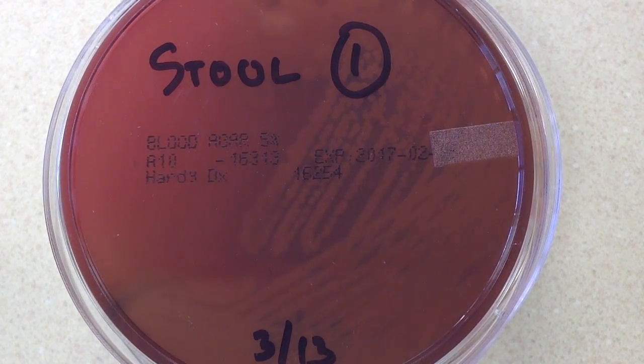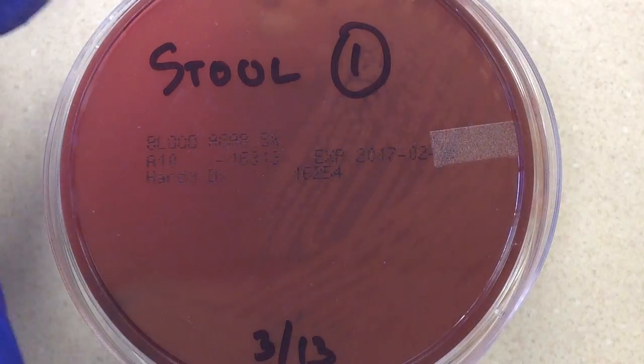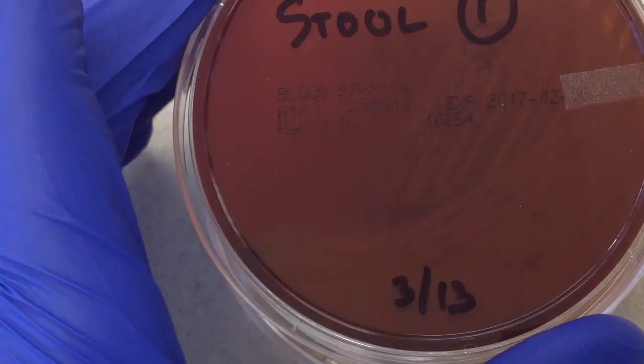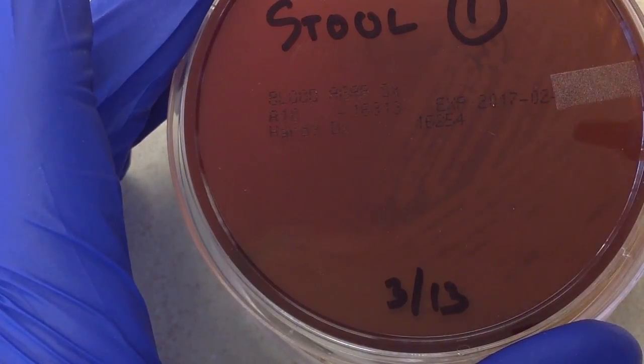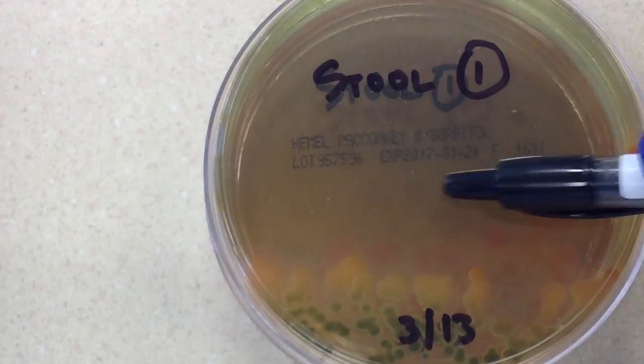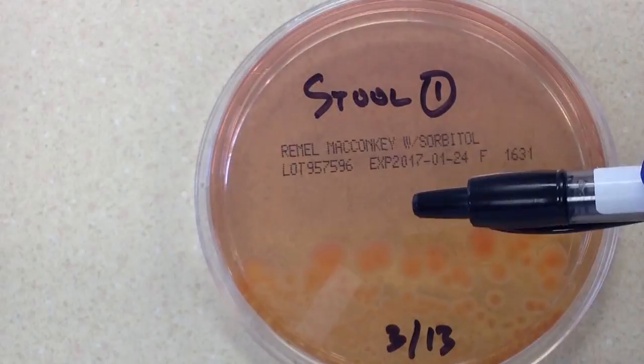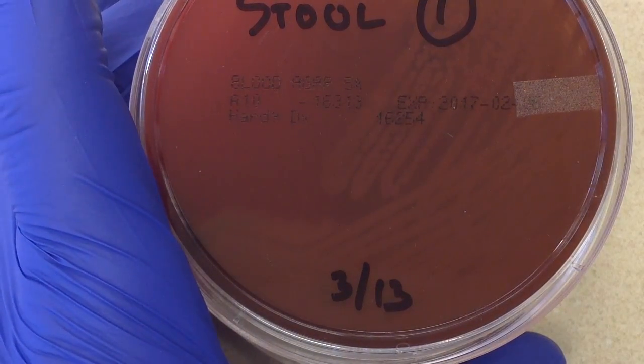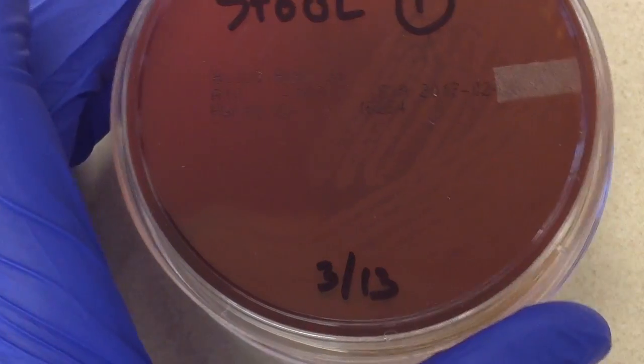This is a stool culture from a patient who was suffering from diarrhea. This particular culture is going to be set up to just a 5% sheep blood agar plate, McConkey's, hectone enteric, and McConkey's with sorbitol. Let's talk about each of these types of plates and what's growing on them.